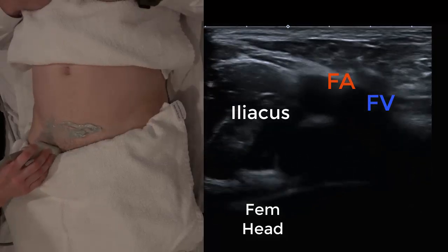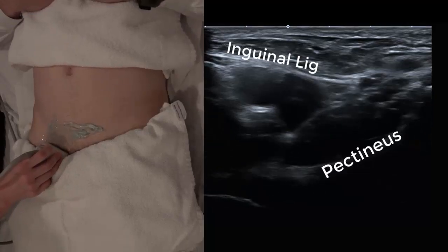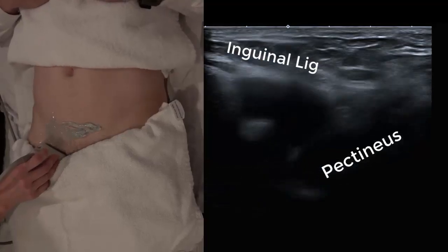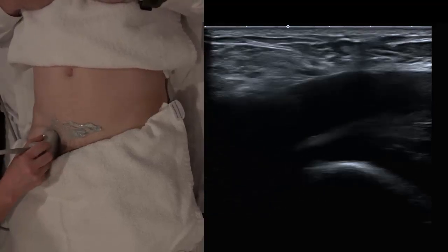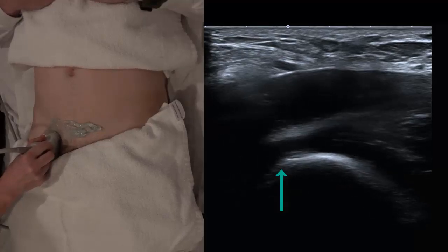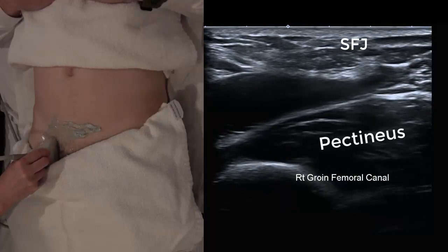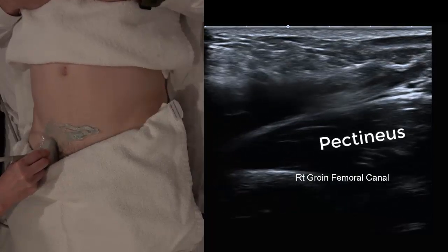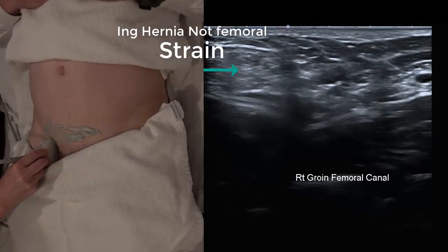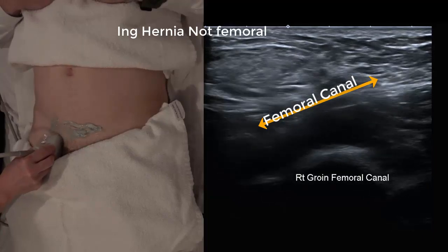We place the probe on the groin crease. In transverse, just below the pubic symphysis or tubercle, we can see the inguinal ligament, vein and artery. We can turn into longitudinal and identify the pelvic rim, the bone in the background, the common femoral vein, and ideally we want to find the saphenofemoral junction. When we ask the patient to strain, the probe needs to be positioned medial to that common femoral vein, where the femoral canal is.